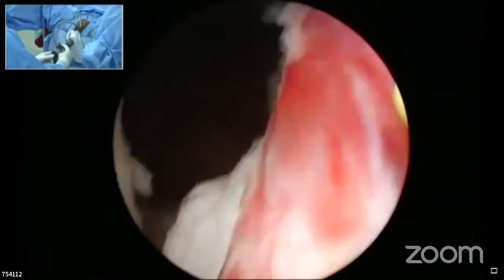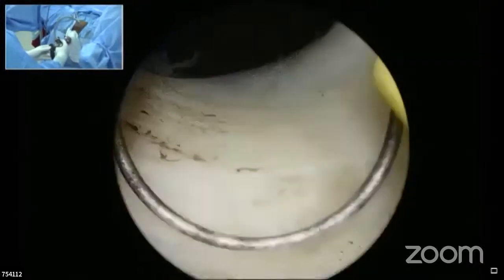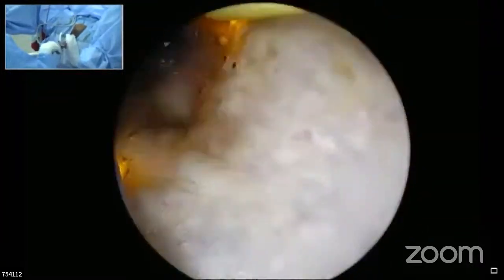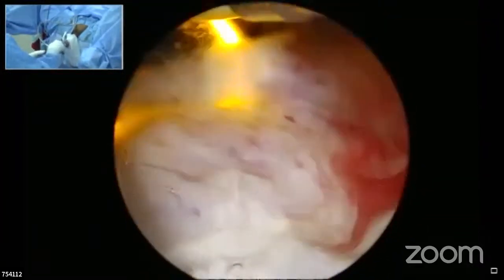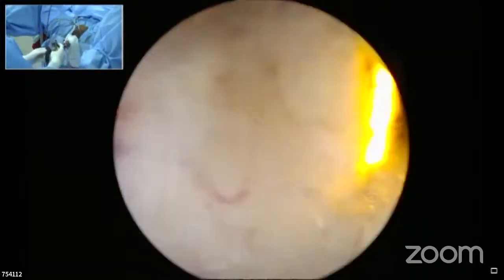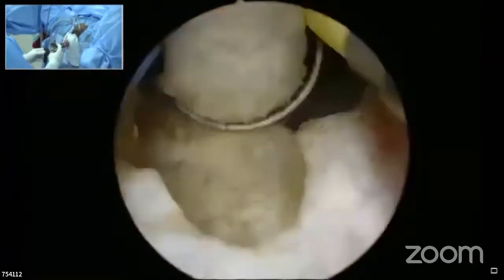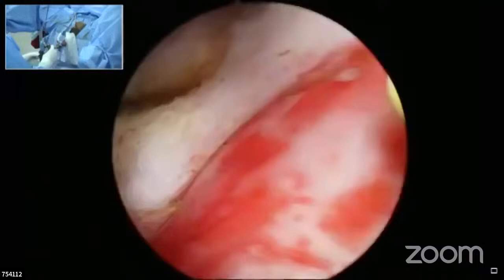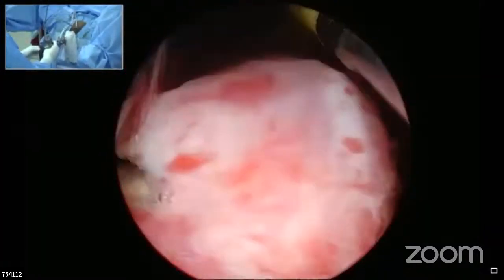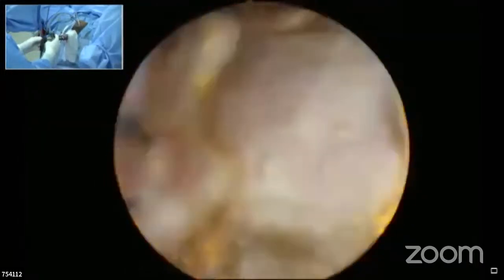One more technique that we can look for in resecting a large median lobe is, rather than resecting here, we can start resecting and debulking the median lobe from above. This would give us space and a safety margin, so that we debulk the median lobe adequately before getting close to the bladder neck or the ureteric orifice. So especially for large overhanging median lobes, this would be a safer approach. Come from above rather than proceeding and widening your grooves.